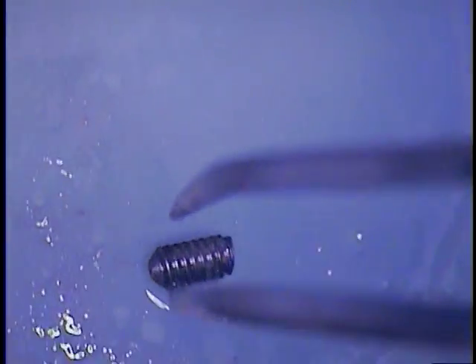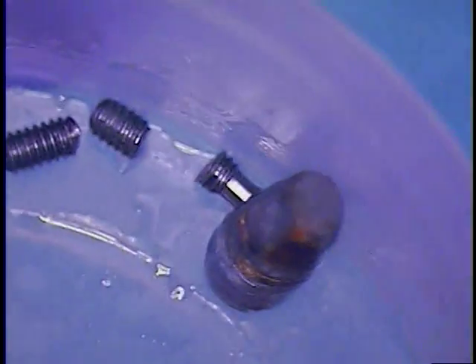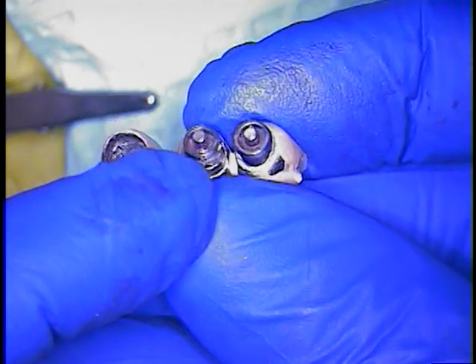Here are the other two — almost magnetic the way they are sticking to each other. Look at how long that one is — it had a shaft on it. Let's look at the shaft on this bridge again. And we will look at the bridge so you can tell a little story here. See how the shafts are still on the bridge?